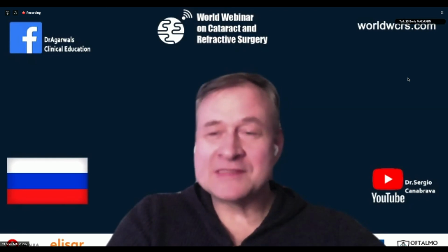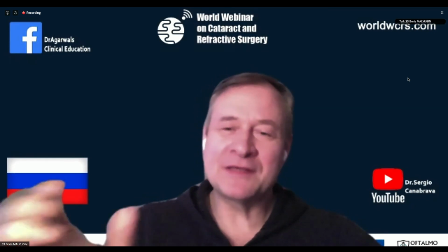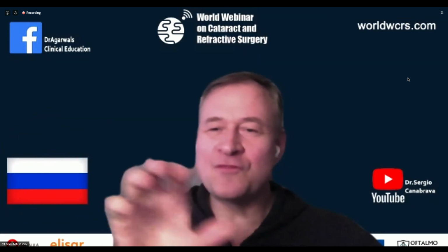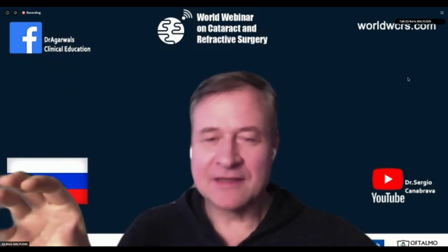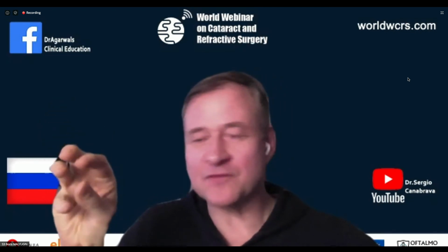However, you still have to be vigilant about that possibility. So what I do is insert the Malyugin ring, and then I try to move it left and right, up and down. If I see that it's moving easily, then it's definitely not catching the rhexis. But if it is restricted in movement in some direction, for instance vertical, then I understand that here is the area where I catch it.